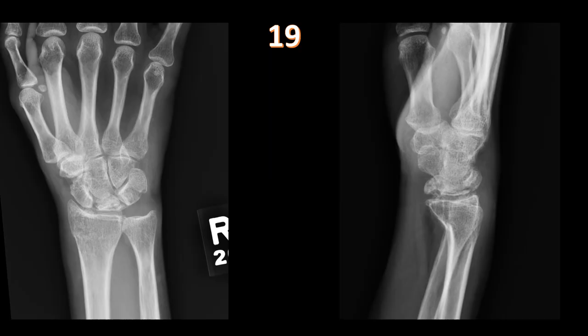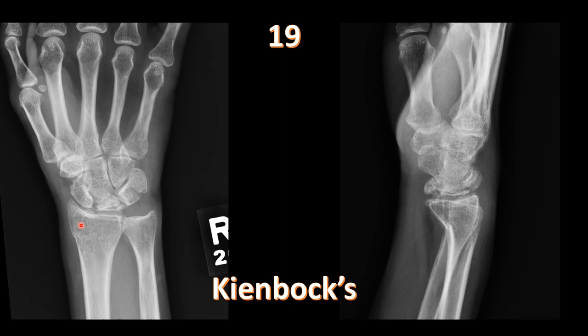AP and lateral views of the wrist show collapse and increased sclerosis of the lunate — advanced Kienböck's disease, which is avascular necrosis of the lunate. This falls under the osteochondroses — abnormalities of cartilage and bone. Many osteochondroses have eponyms and are caused by vascular infarcts, microtrauma, or a combination. Kienböck's disease is associated with an ulnar-negative variant.